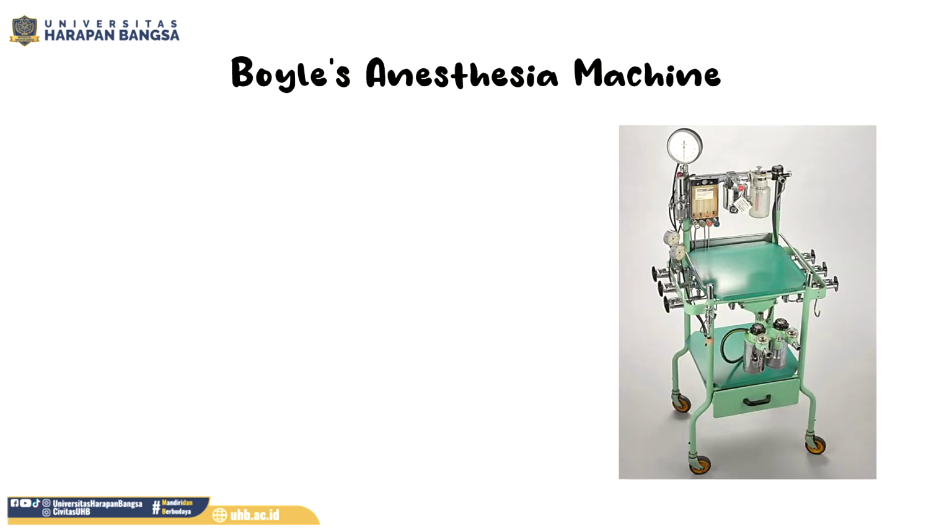Next, this is Boyle's anesthesia machine. This is the machine of Boyle's that was made by the British Oxygen Company, or BOC, in the 1950s.